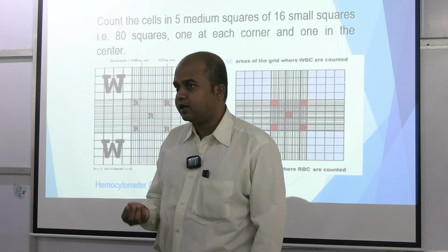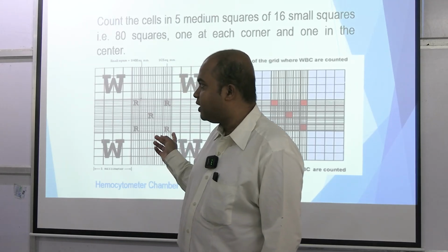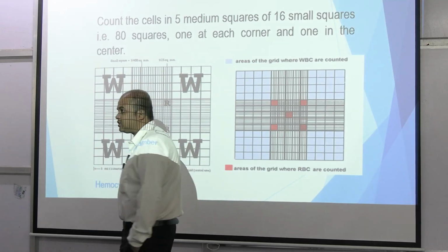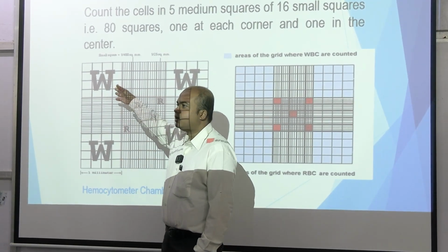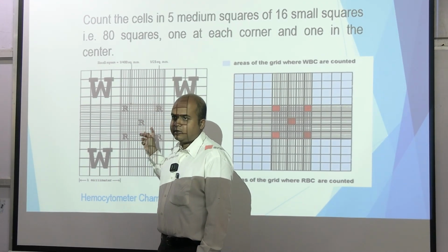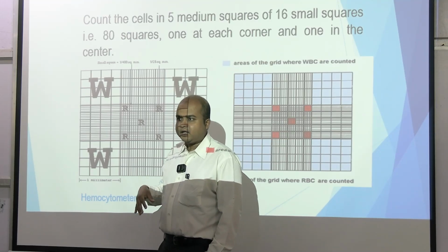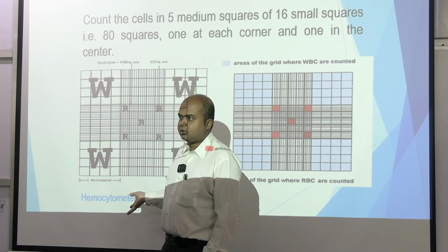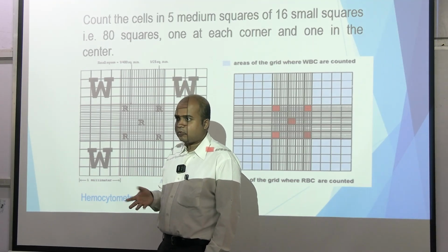As we are taking our own blood, with a uniform distribution, x is expected like that, but whatever comes you have to write. If x is to be 100 and you are counting 4 squares, then roughly it will be 25. Don't show 25 for all squares. It can't be that uniform. So it may be 30 in some, 40 in some, 20 in some, like this. That is what is expected, calculating backwards.